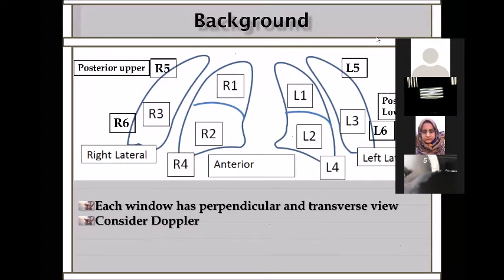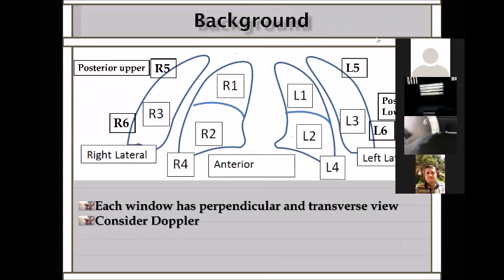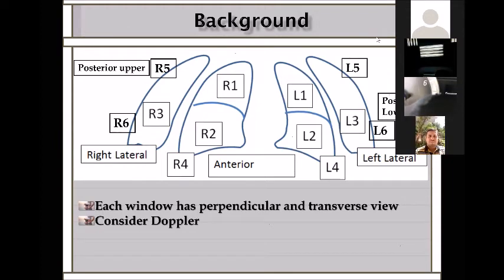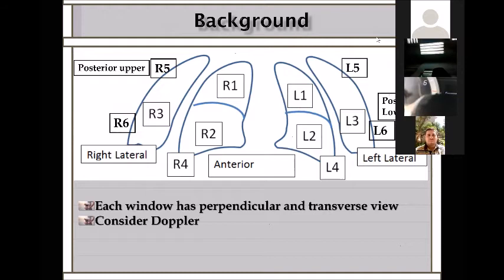The technique of using ultrasound on the lung: because we are not radiologists and not familiar with the machine, we select specific scan windows and areas on the lung. These areas include R1/L1, the upper anterior part of the lung; R2/L2, the right and left lower anterior part; and R3/L3, the lateral aspect of the lung. Then we have two areas on the back: R5/L5 and R6/L6, covering upper and lower posterior.